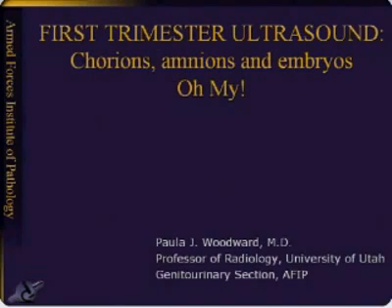I want to welcome you to what I hope is going to be a very interesting session on obstetrical ultrasound. We're dividing this into two parts. I'm going to do the first trimester, and then Dr. Nkwako is going to go through anomalies in the second and third trimester. So let's go ahead and begin with first trimester.